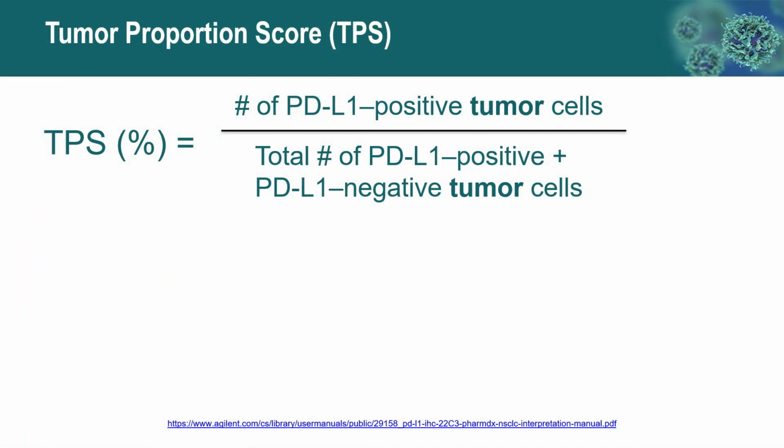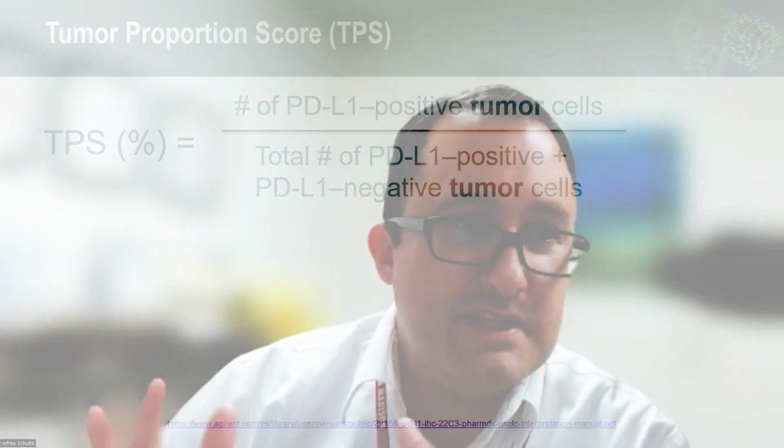If we're developing something, say, using a TPS score, we may determine up front that we want a range of 10 to 20% as being considered in control or acceptable comparison, I should say. But if you send it to a reference laboratory, they may say PD-L1 greater than 1%. And so how do you know, unless you review that slide, how do you know how comparable those stains are? So that's been a challenge in doing these validations.